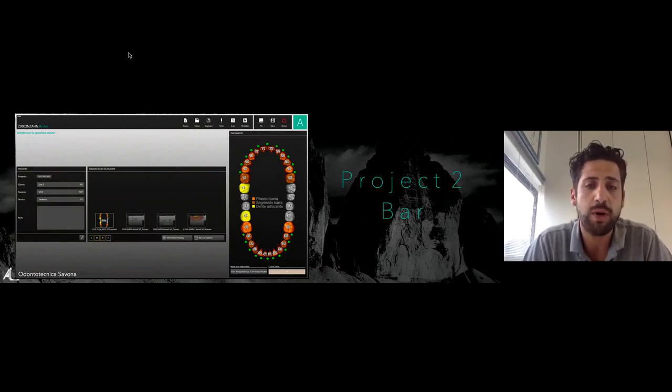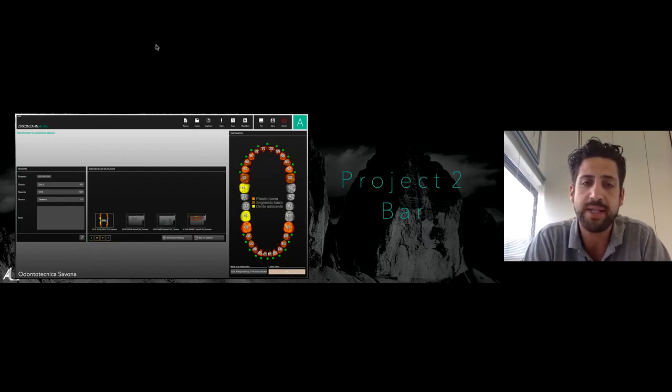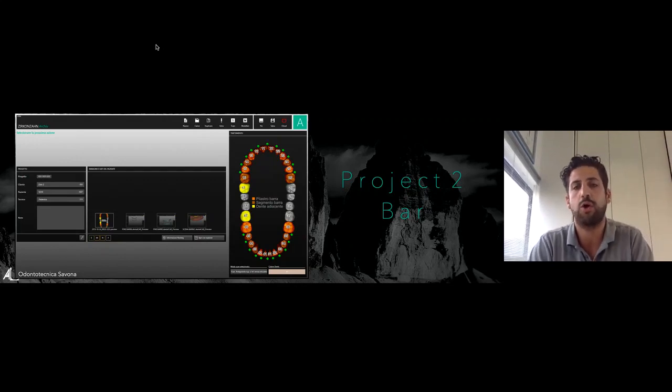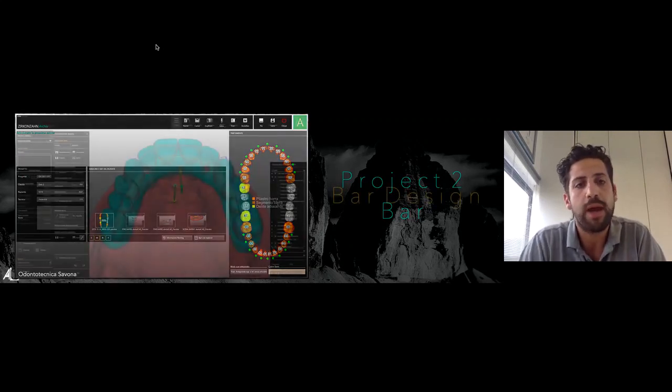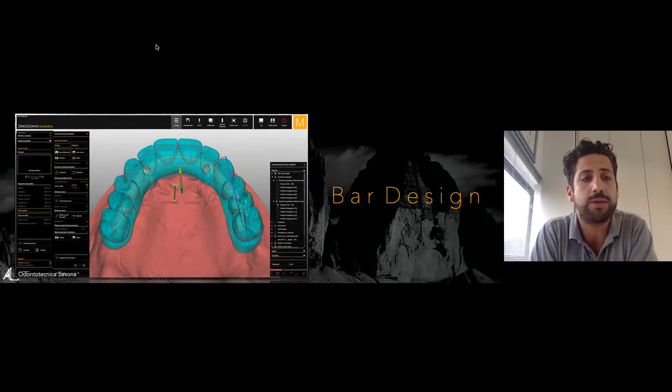First of all, it's really important to make two bars. Now in our protocol, in our lab, for every kind of Prettau bridge, like the Toronto bridge, in that case, we like to use the titanium bar inside of the zirconia. This is a big advantage because we have the possibility to make stability between the implants. Also, we make our zirconia stronger. We can be a little bit relaxed and not too much in danger.